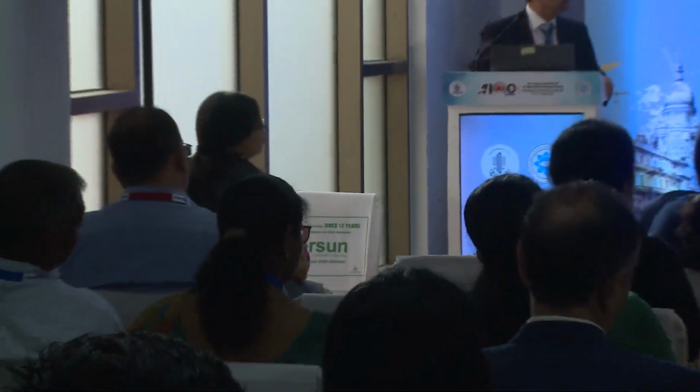Daraius, I have a question for you. When you showed these beautiful images, are you doing simultaneous FA and OCT in the same patient? We did a pilot study with Dr. Shishir Narayan some years ago where we did do that. Now, since we are confident about the OCTA, we are not doing it simultaneously. But when we got the OCTA new, we did it on the same patients on both.